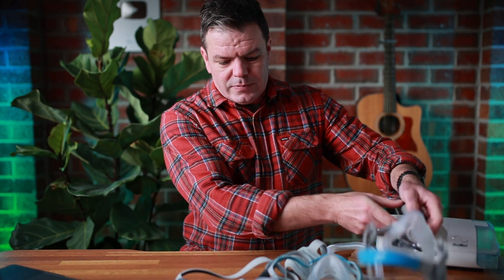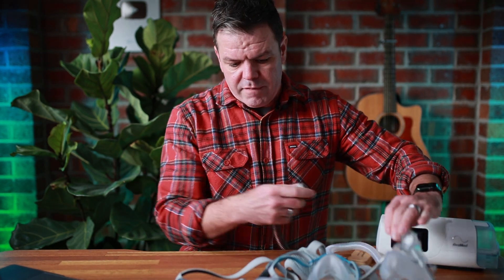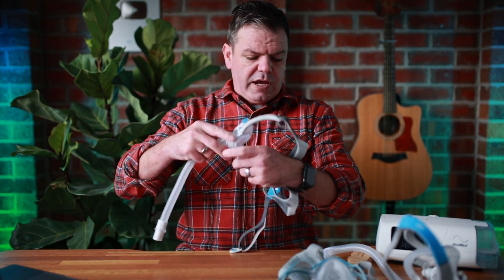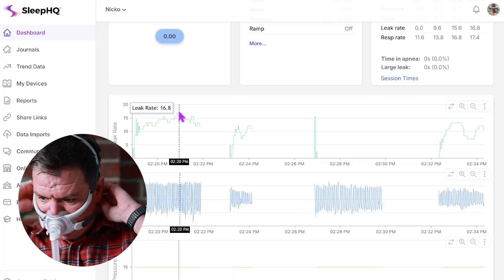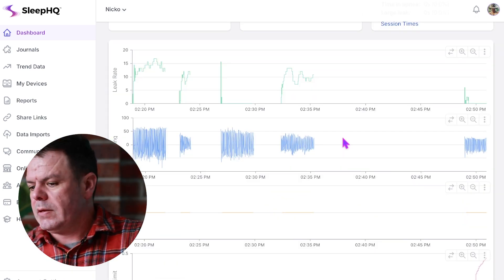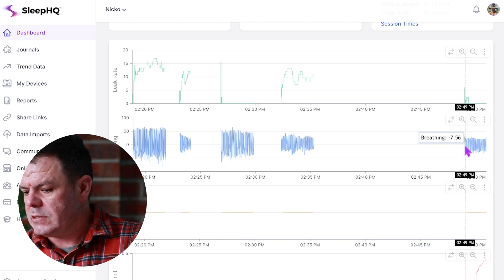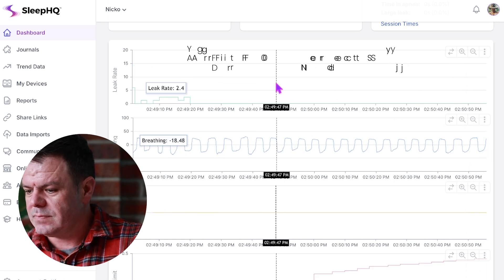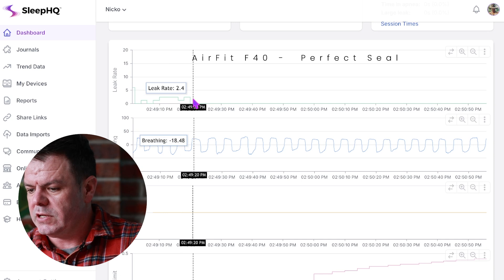Smooth as a baby's bum — let's go. Starting with the F40 again. What were we, around the 15 mark? Big difference — check that out — virtually no leak.